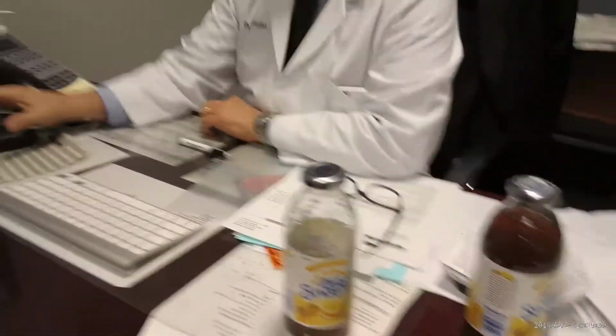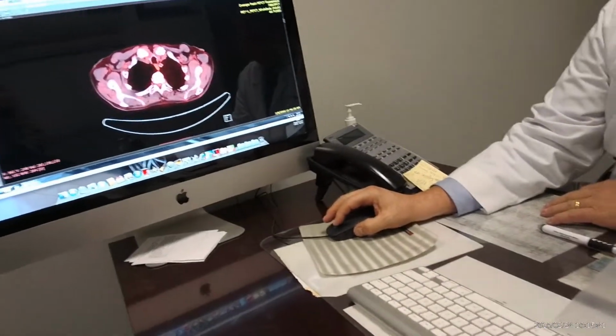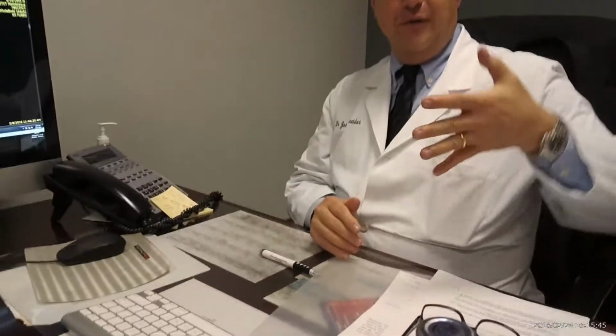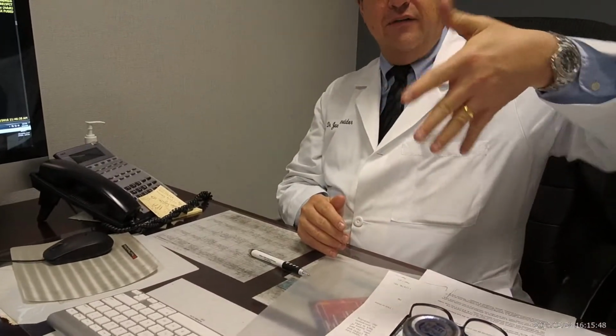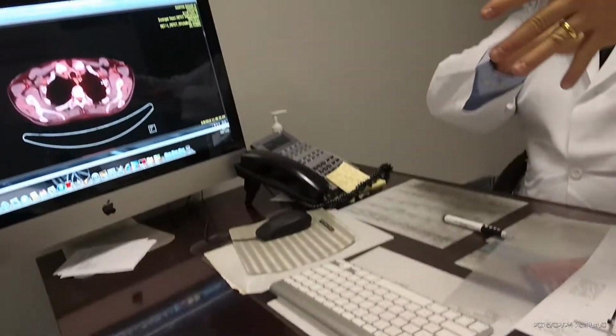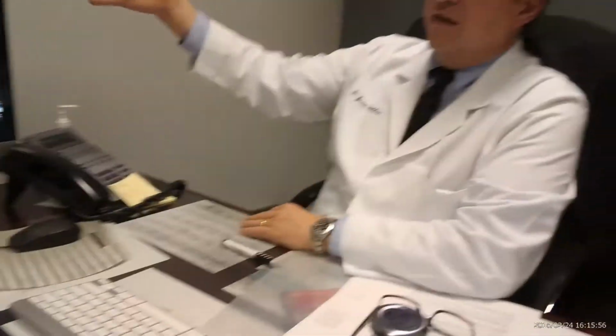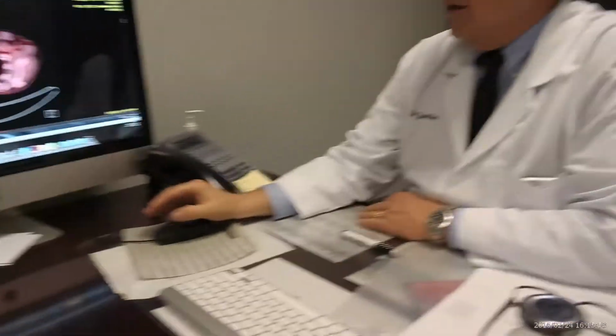At this point, what we're seeing is, and these are your ribs, by the way. And the reason we only see part of the ribs is because if you look at yourself in the mirror, your ribs don't go perfectly straight across. They kind of go on an angle. So as the slice comes through, it takes a little of this one, a little of this one, a little of that one. The computer has all these slices put together. God bless the people who engineer this stuff.